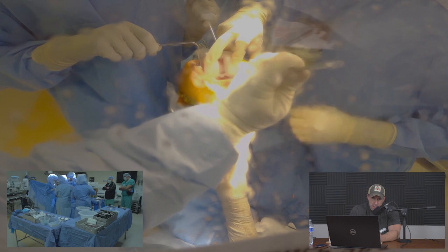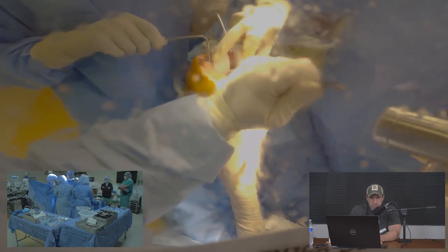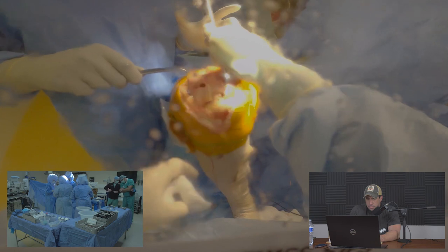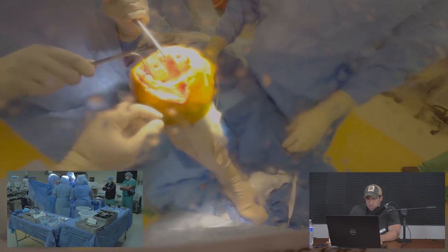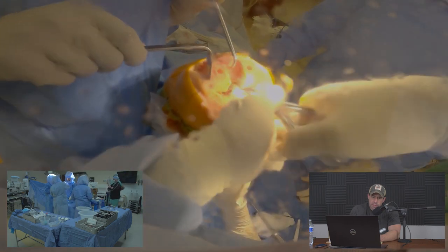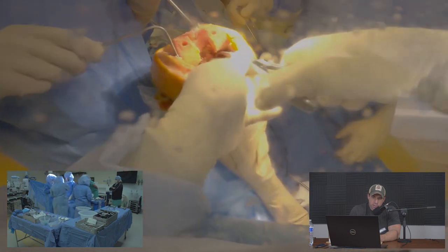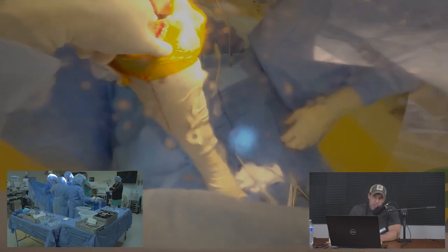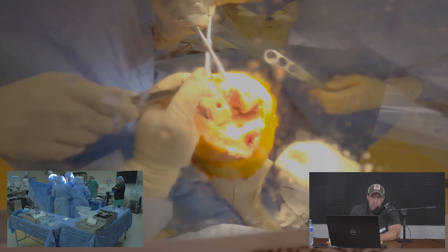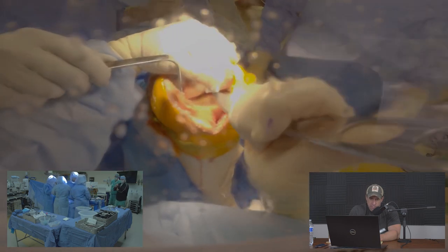Using a small osteotome I remove those bone spurs, then extract the loosened pieces. We want to make sure everything is clean in the back of the knee — protuberant bone could cause pain, and more importantly the soft tissues must drape across this area, so it can block range of motion. Getting all of that out ensures the patient has the maximum possible range of motion with their implant.